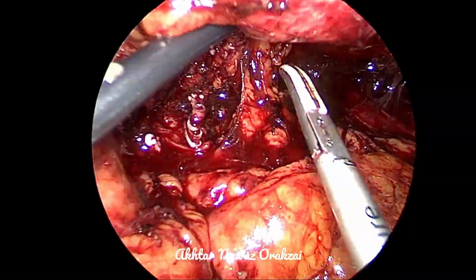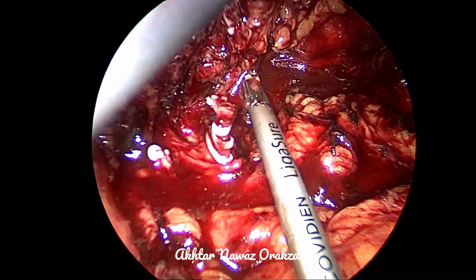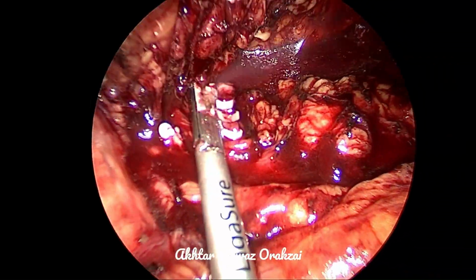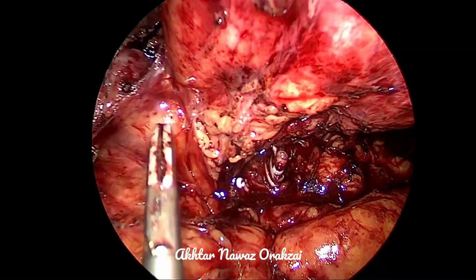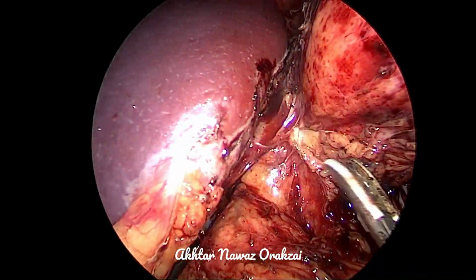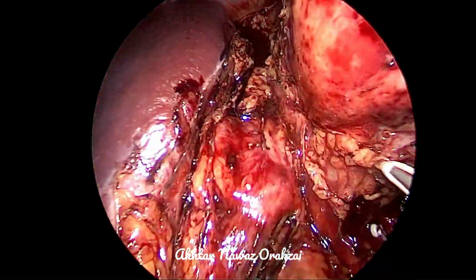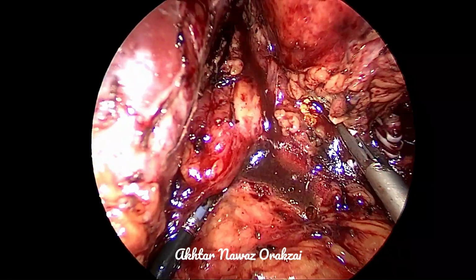So we quickly apply clips and then divide the artery, because there is pooling of blood, maybe there is congestion of some tissue, and then we use the suction to clean up the area and do the bipolar to do the coagulation and make the area clean.